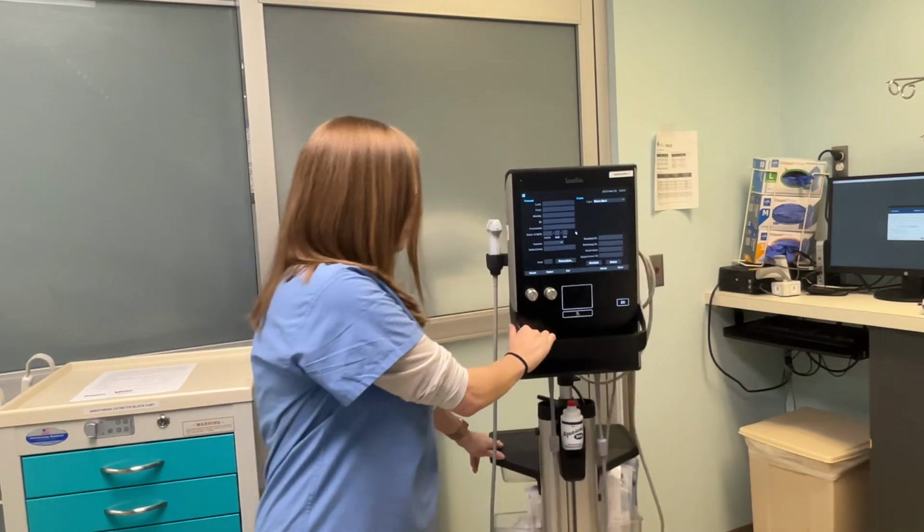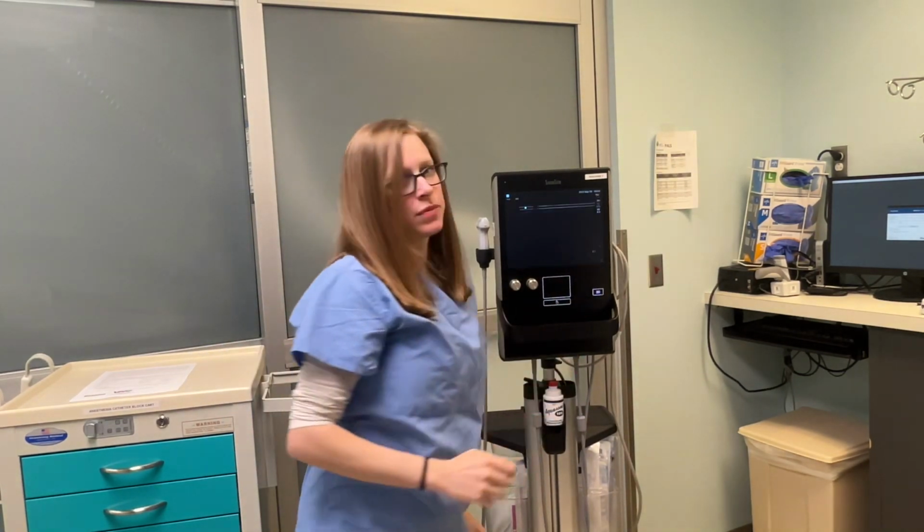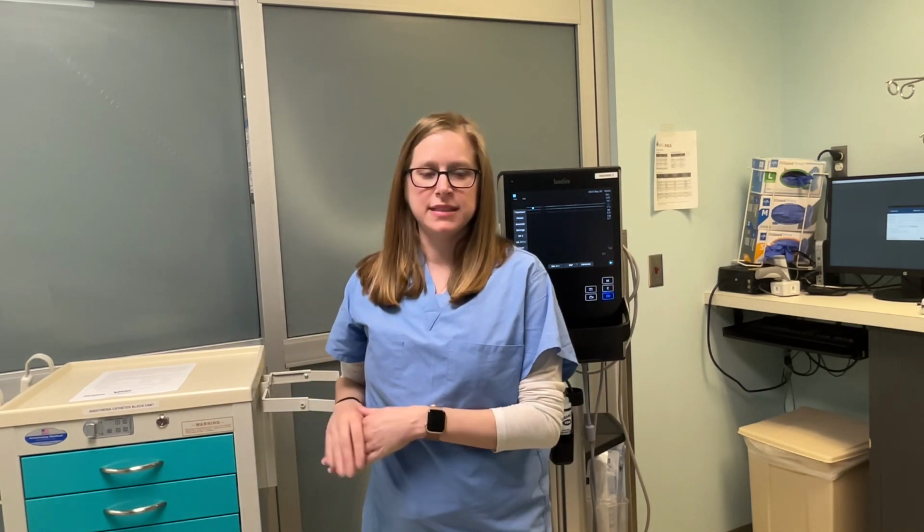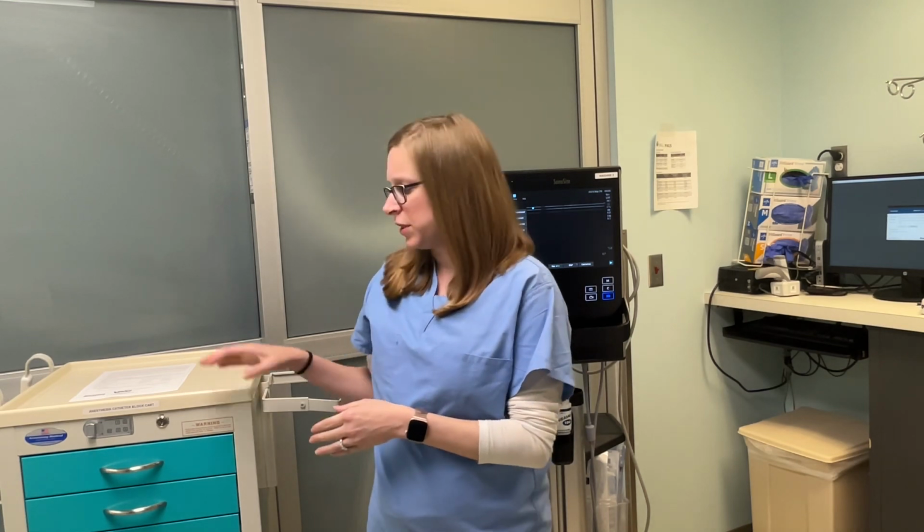For the setup of the procedure, you're going to check the laterality. So if it's an extremity, you'll check the extremity laterality, and on the surgical side is where the anesthesiologist will be. For rib fractures, you're going to want to check the laterality with the anesthesiologist. For the procedure, you're going to set the bedside table next to the anesthesiologist on the operative side, with the block cart being at the end of the bed.